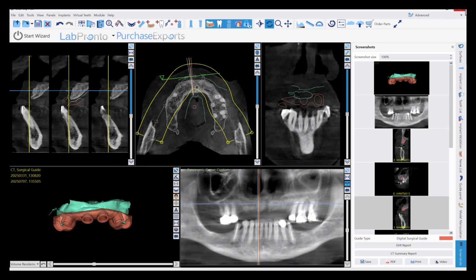That's as much as I can do on this case right now, but hopefully you see the value in having more data. Always take facial pictures for anything full arch, for anything in the anterior. Make sure you've either got facial pictures or a facial scan, or both preferably, because there are so many things I just don't know until I verify that, and that will get done. So don't think that this is the final plan. It could be that we use this, it could be that we trash it and go tweak some things, but anyway, hopefully you see the overall approach of how I did that and picked up a few little tricks.